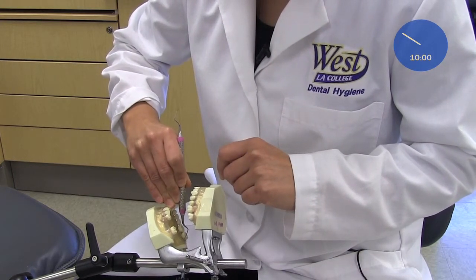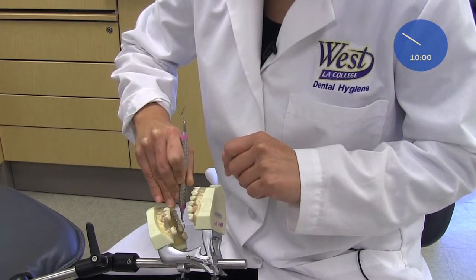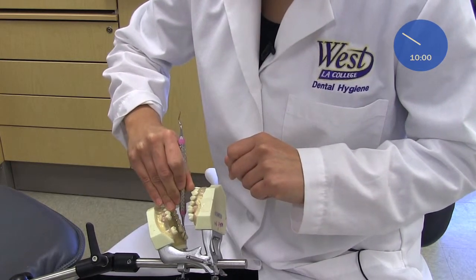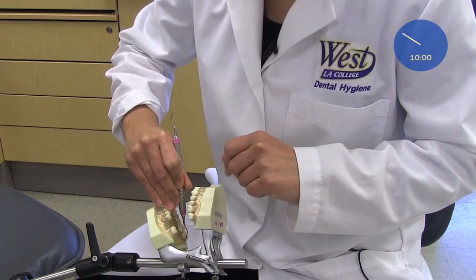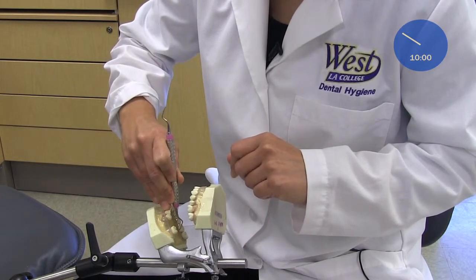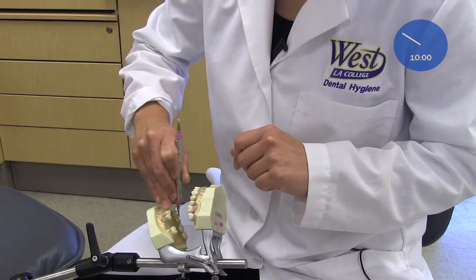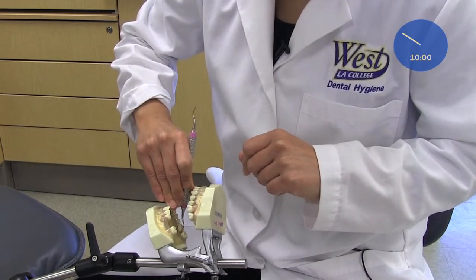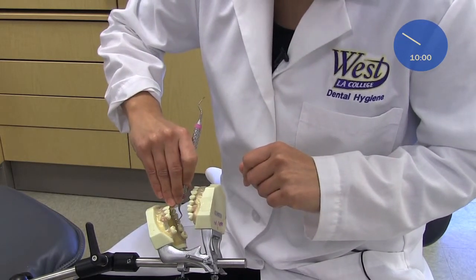You're going to start from the distal surface going to the mesial — all the way in and then come out. You can do the distal; make sure the terminal shank is parallel. Then work the distal-lingual line angle. As you're coming to more premolar, you have to change your fulcrum position more closer to the teeth.